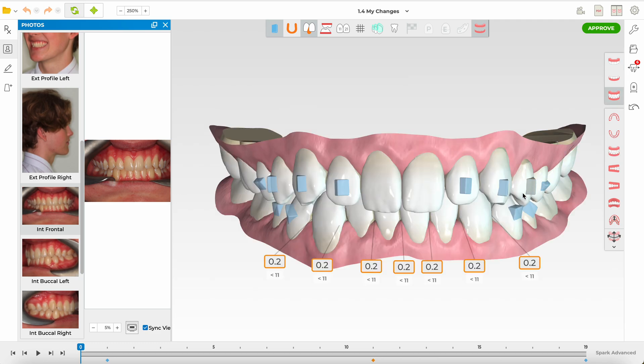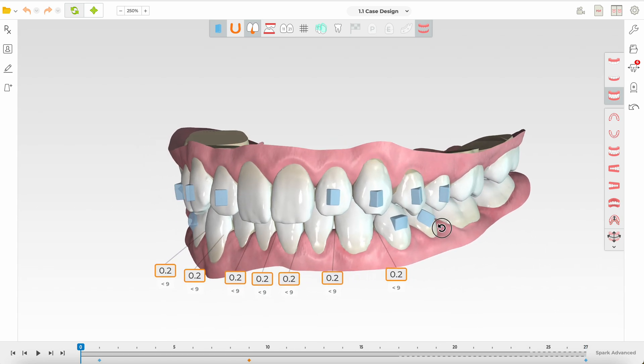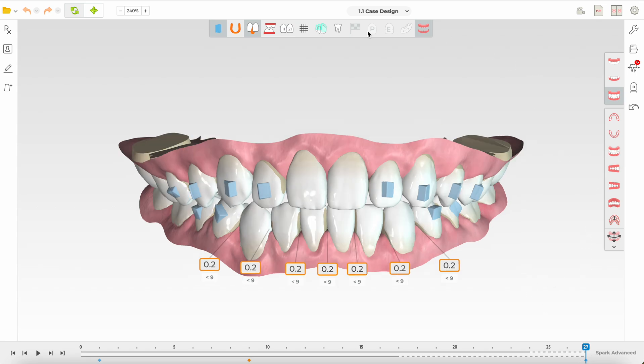This is a Spark setup and today I'm going to show what happened in this case. Looking at the very first case design, I must say this is not a technician issue — this is an issue where whoever prescribes can give very erroneous instructions that produce a really bad setup. This is a slam-dunk easy case; it's just mild alignment and you don't want to change anything in this patient's smile. But the first design came back with a lot of intrusion of the upper incisors.